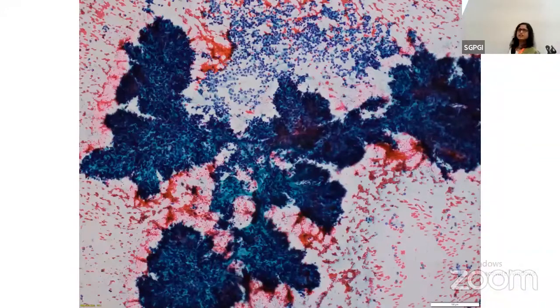Very good. So in which type of medullary do you see papillary fragments? Is there any variant? There's no variant of MTC, but you can get various architectural patterns. So there's a pseudopapillary pattern, but in this you are having true papillae. So this was a problem for me. It didn't look like PTC to me. I was not sure what I'm dealing with. There were no inclusions. So we're calling it category 6? You need to have intranuclear inclusions, Psammoma bodies, and papillae. We did have one, but we didn't have the other 2.